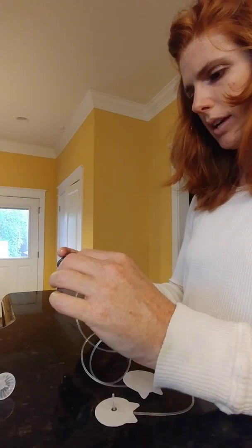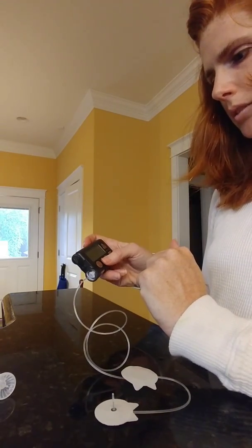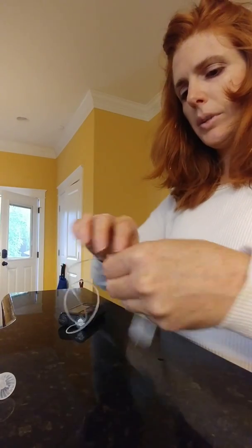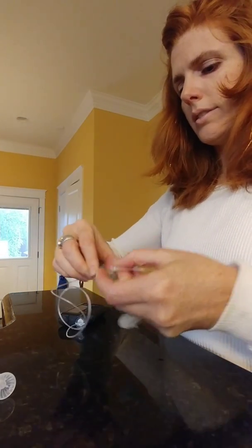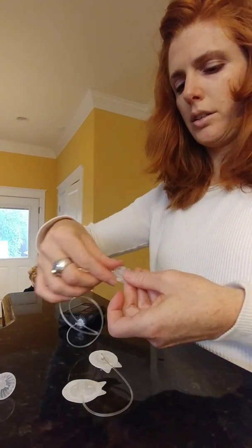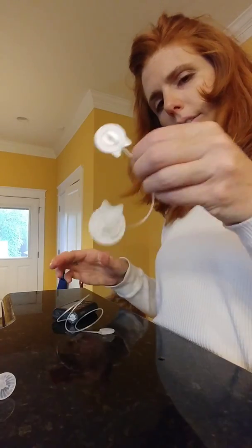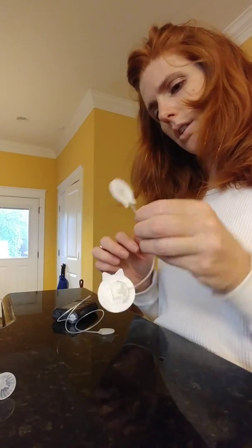So that's it. So now we hit escape if we're done, and escape again. And then we disconnect the site from the tubing. I put the cap back on to keep it clean, put this back in his pump belt, and then this is what I actually use to insert into Grayson's body.